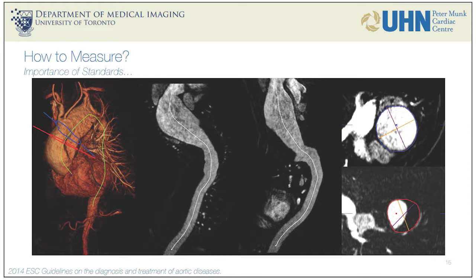And clinicians are heavily depending on those measurements in terms of their therapy decisions, especially in young patients. Does a patient need to undergo surgery in case of Marfan's disease, or is it still good to follow up? That's very important these days. But in case you go for those cross-sectional measurements, keep in mind, and David Salomon mentioned this morning, it's sometimes very tricky to get the accurate measurement because the windowing is so important.